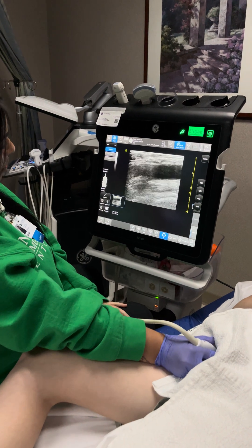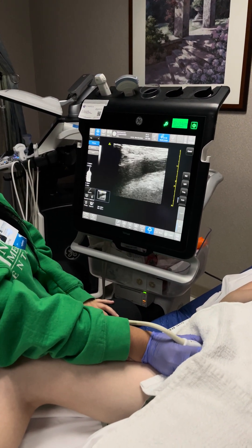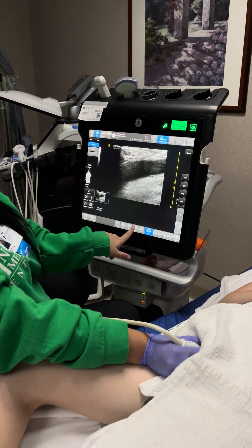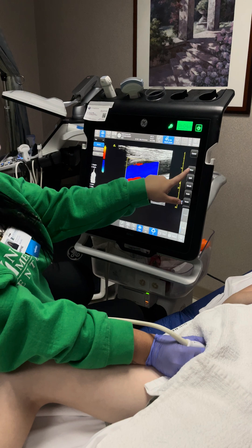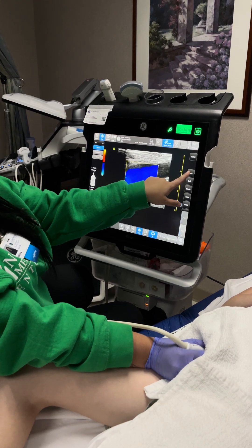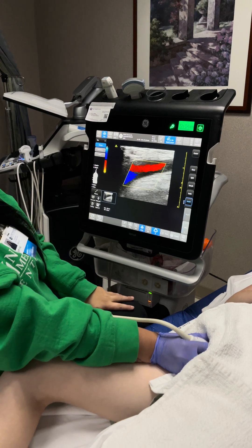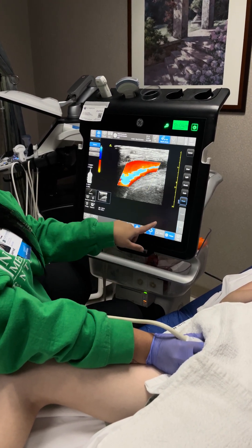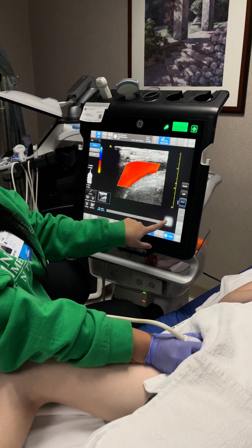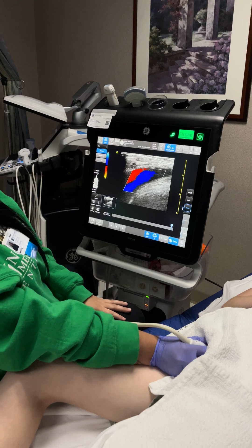We can also turn on color flow by hitting our color button, and we're going to steer our box. We can freeze our image, scroll back, and we're getting beautiful venous flow.